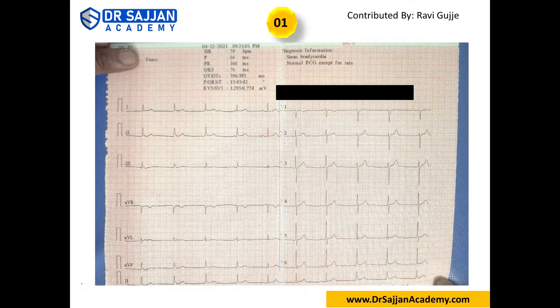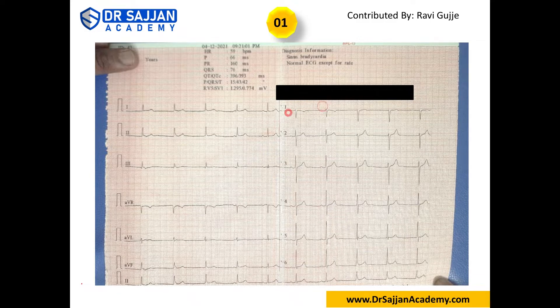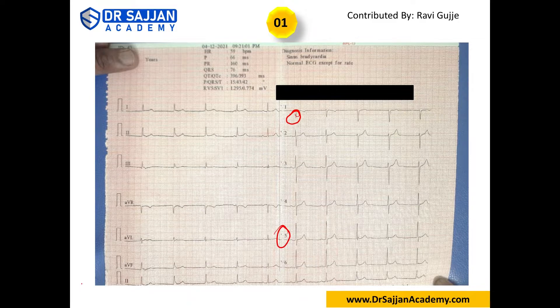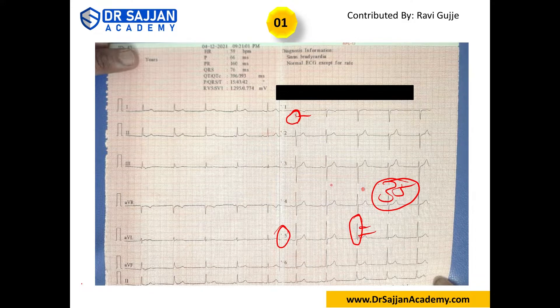Q wave is not present. Coming to hypertrophy: for right ventricular hypertrophy, in V1 the R by S ratio should be more than one — meaning R should be tall and S should be small — but that is not happening here, so it is normal. For left ventricular hypertrophy, we add S of V1 and R of V5: it is about three boxes, meaning 15 mm. Normally it has to be more than 35, so that is not present.